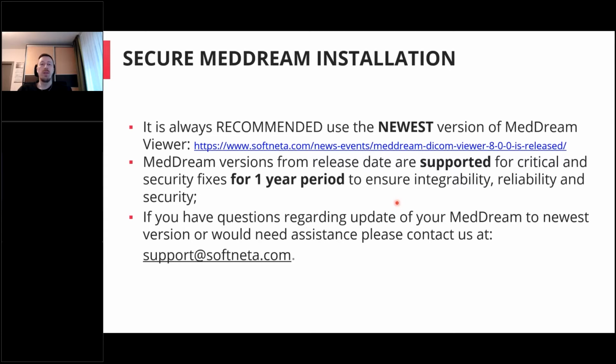If you have questions about how to update, or you need assistance, just let us know and contact our support team, and we will guide you through the update. But it is pretty straightforward.